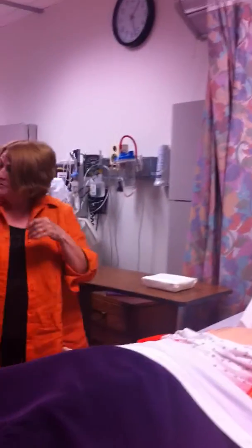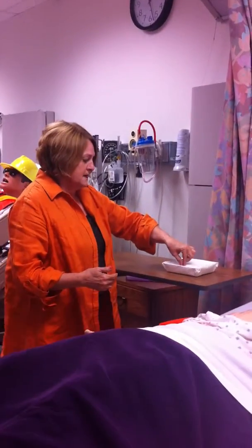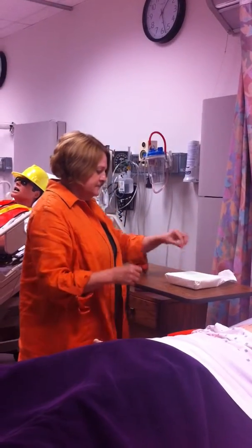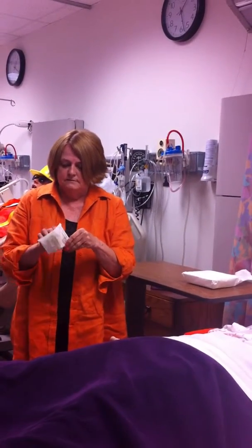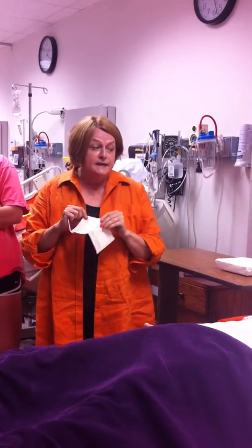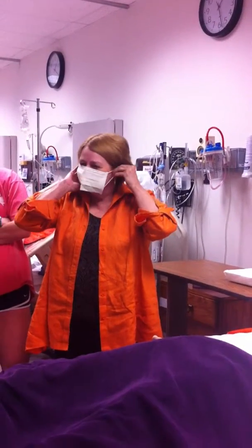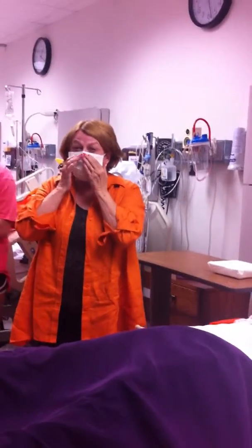Okay, when you're opening a sterile drape, if it is packaged, you should open it following the ABCs. Away. And there is my mask. And I'm going to go in and put it on because I'll get it out of my way. Many hospitals require that the person doing the dressing change and the patient wear a mask as well as anyone in the room. So you have to follow your agency's policies about wearing a mask. I usually try to get the people in the room to leave. It's just a lot fewer germs and breath floating around in the air.